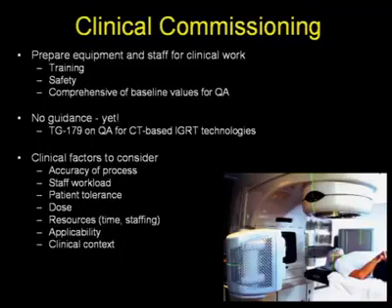So all this is to say that the clinical commissioning should be guided by the clinical context, and the multidisciplinary team should define the goals that are to be achieved using IGRT technologies.